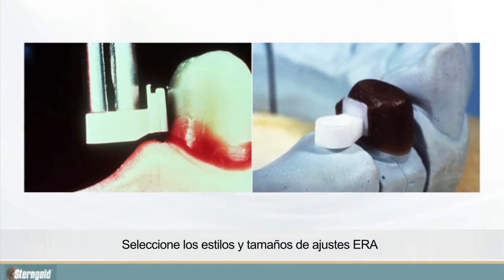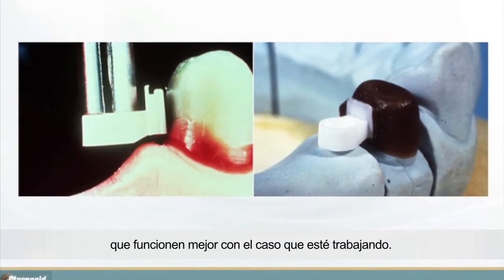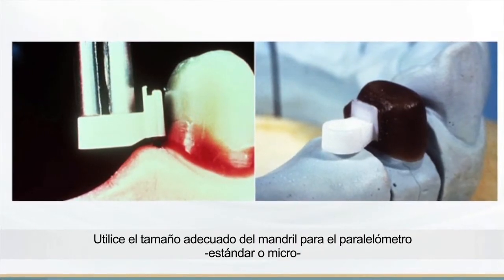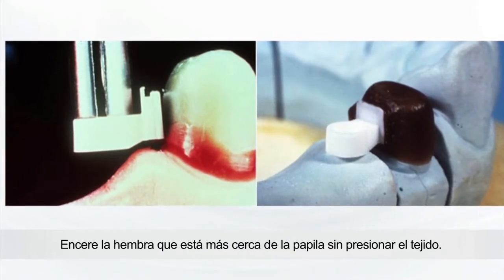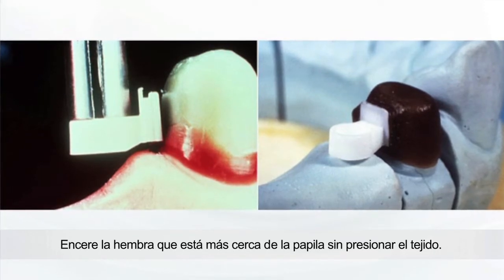Select the style and size of ERA attachment that works best for the case on which you are working. Use the appropriate size paralleling mandrel, either standard or micro, to place the female. Wax the females close to the papilla without impinging on the tissue.